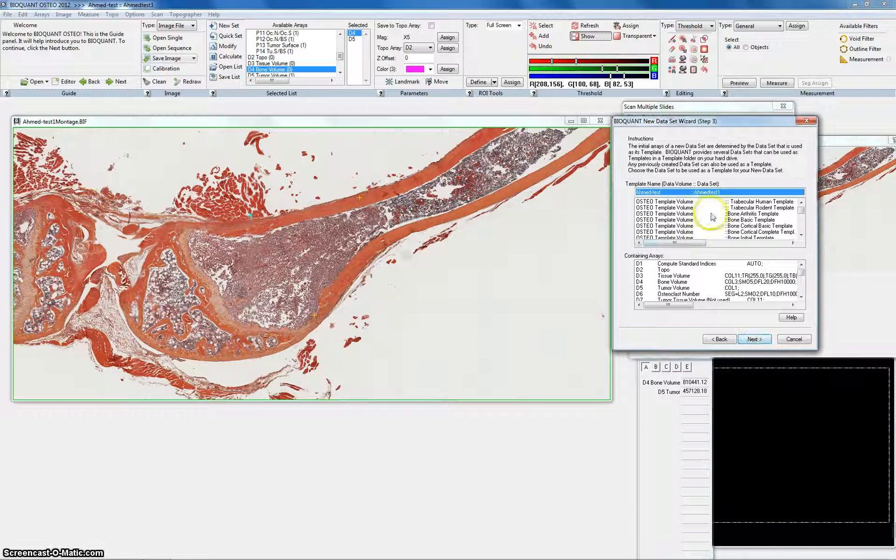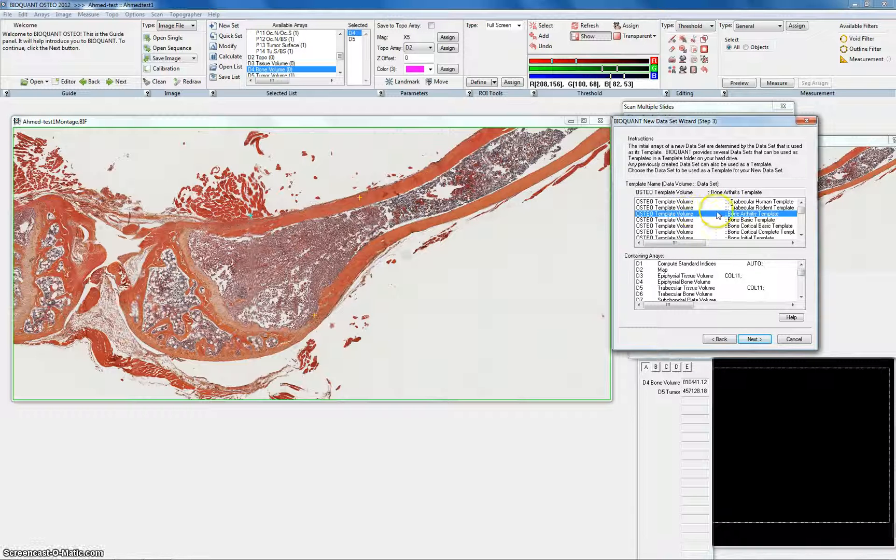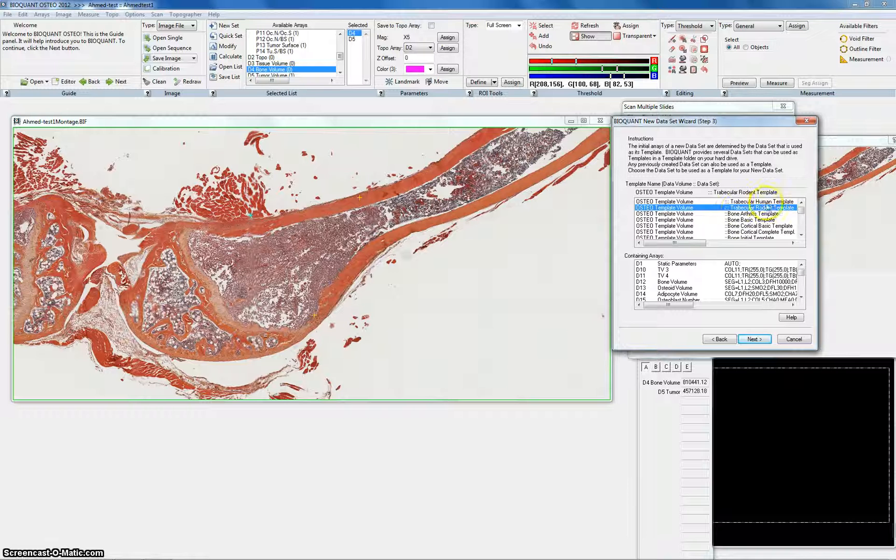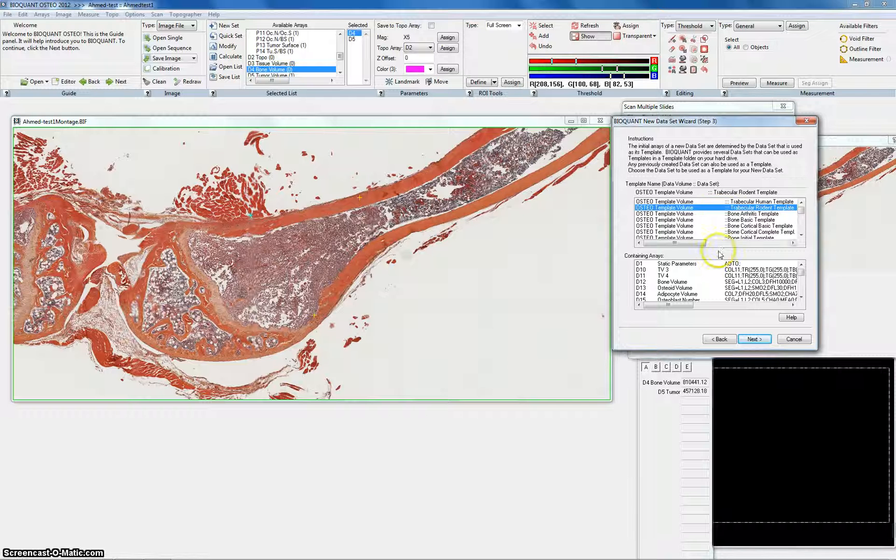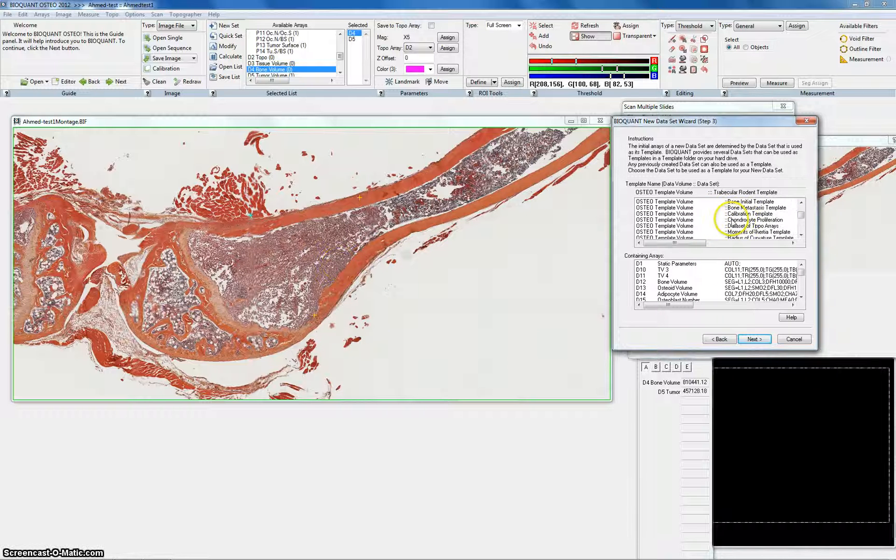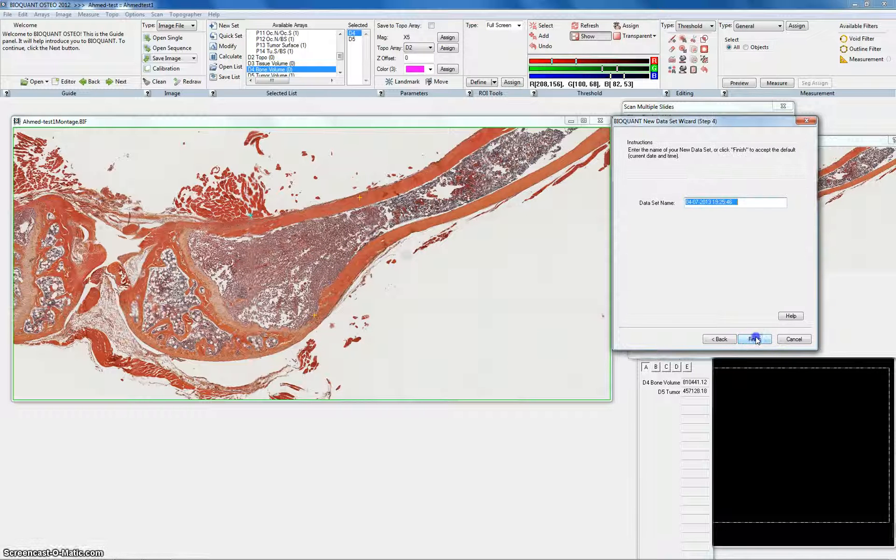After that you hit the template that you want to use. Usually I use the trabecular bone template, the trabecular rodent one for the non-tumor bones if I want to measure the trabecular bones. Or in this case since it's tumor bone I would get the bone metastasis template. And then I hit next.